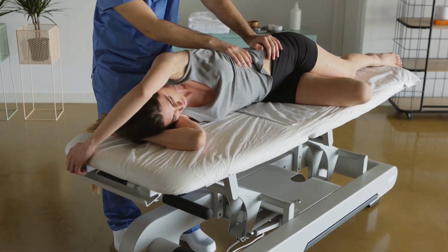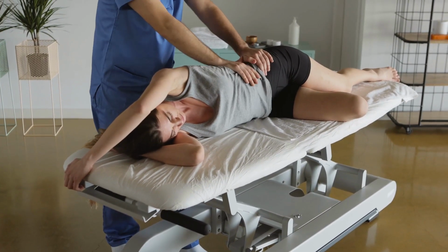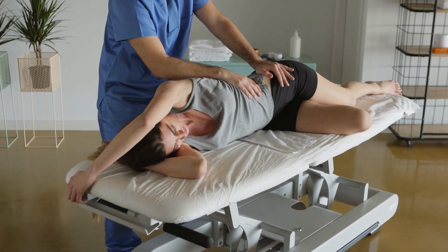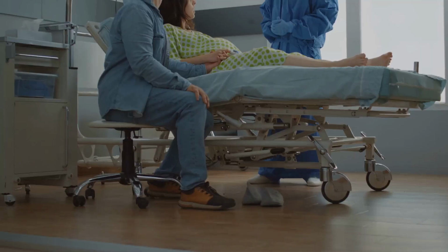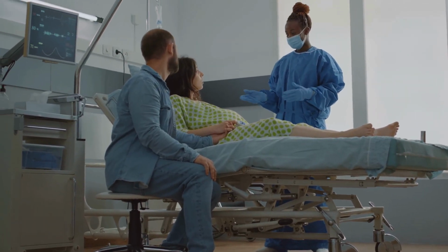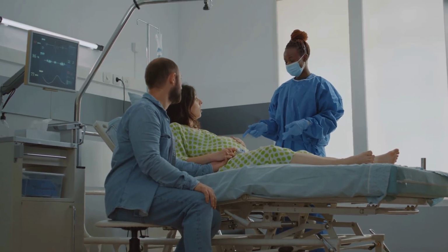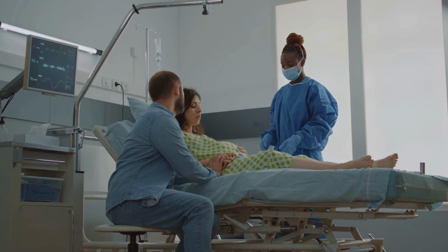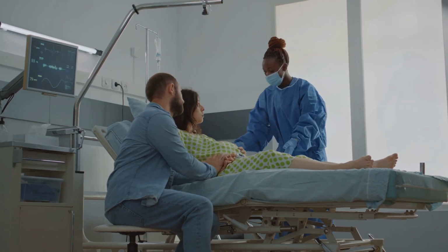Knees should be drawn up to their chest, with their chin tucked in. This position also opens up the spaces between the vertebrae, facilitating the procedure. In both positions, it's essential for the patient to stay as still as possible. Movement can make the procedure more difficult and increase the risk of complications. Remember, correct positioning can significantly enhance the success rate of the procedure.